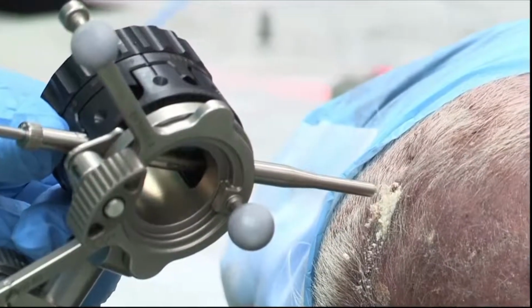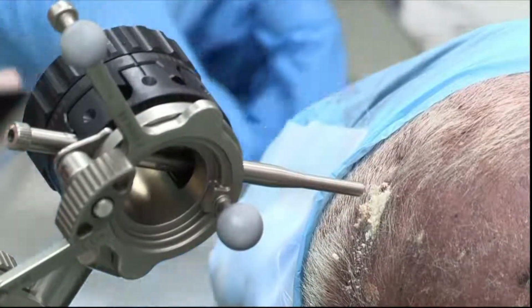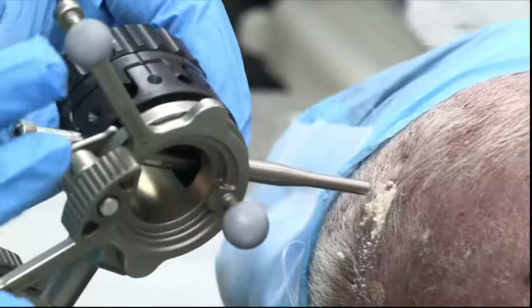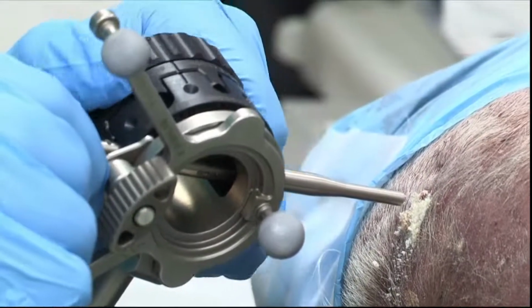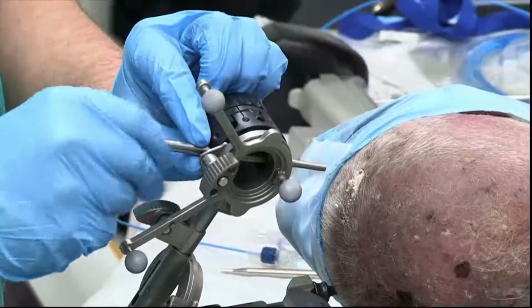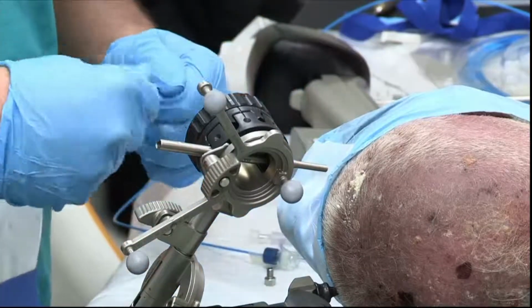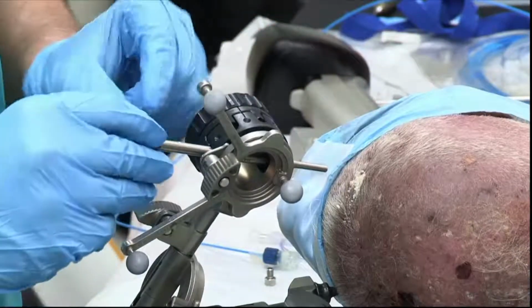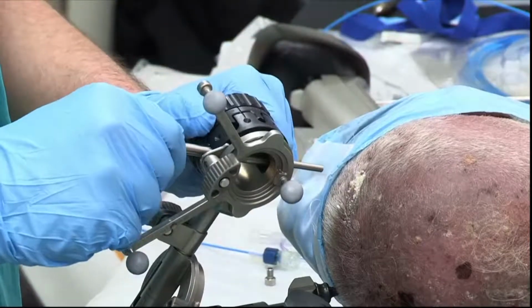There we go. Perfect. So, next thing we want to do is your arm stays in place. Nothing's actually secured yet. Don't move the arm. That can happen, and then you got to start over. But you want to just back your stylet out, and actually what we're going to do is change out the inner cannula to make sure we have a snug fit. And this is exactly how we put in stereo EEG leads as well. The only difference is obviously what you're putting in, but the technique is the same.